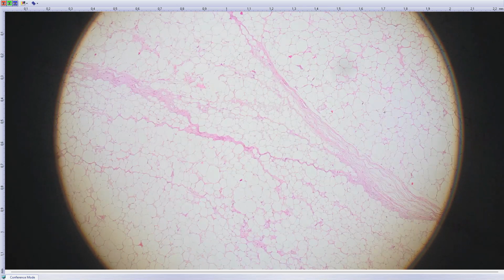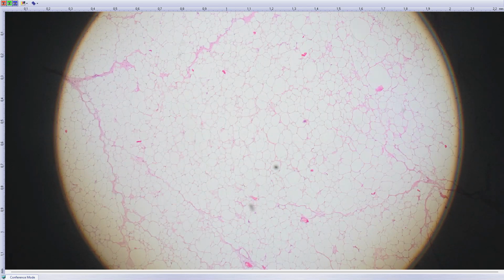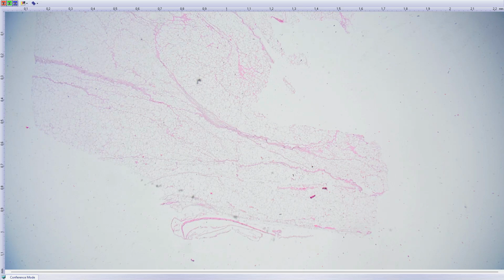But here, you stop because this is looking unusual for lipoma. The first thing you can mention is that the size of the fat vacuoles is not very uniform. There are huge differences in the size. In normal lipomas there is also some variation, but it's not very great. Generally it looks like normal fat. The other thing you may notice, especially on the scanning magnification, is that there are these quite thin but quite numerous fibrous septae.